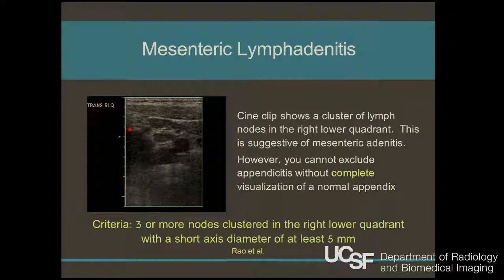I see this happen frequently. The tech will measure something like, I think that's the appendix, and I go in there and I say, no, that's some bowel. Really get to know what an appendix looks like on ultrasound, both normal and abnormal. I don't know if that's covered elsewhere in this thing. Maybe I should start adding that to this lecture, because it is something we're asked to do more and more and more.